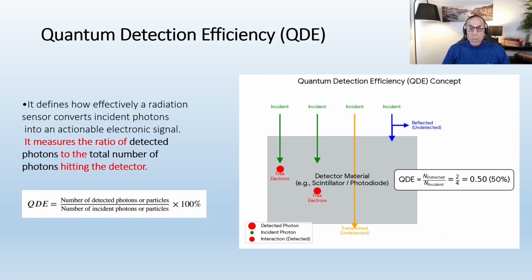This means that for the exact same number of photons hitting the detector, a CBCT panel produces more quantum noise, requiring a higher relative dose to achieve an acceptable signal-to-noise ratio. It reflects the probability that a photon will interact with the detector material rather than passing through.